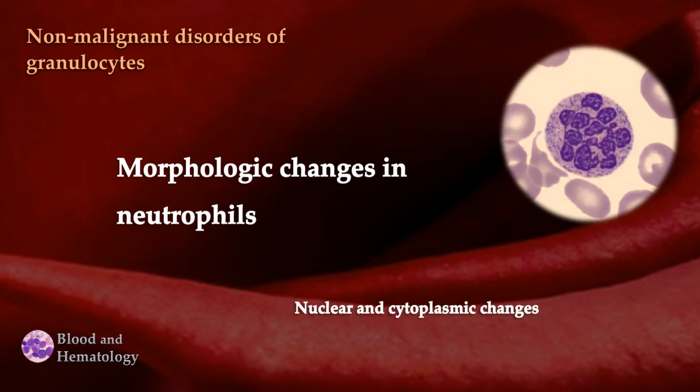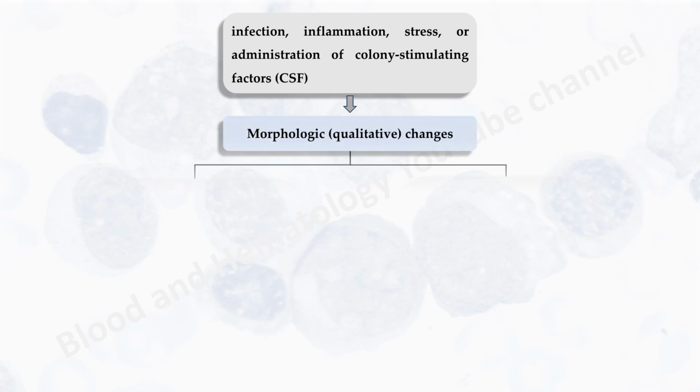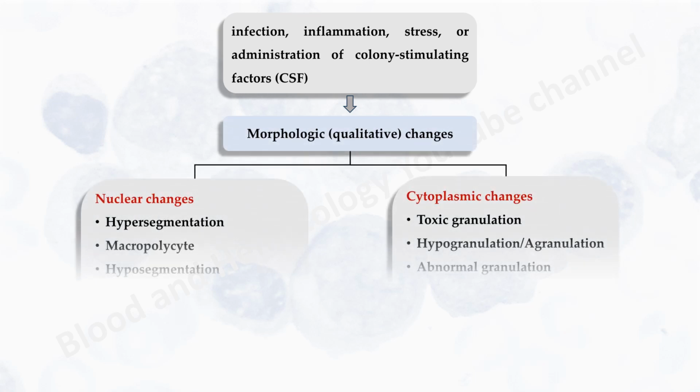This video is about morphologic changes in neutrophils. Conditions such as infection, inflammation, stress, or administration of colony-stimulating factors induce morphologic or qualitative changes in nucleus or cytoplasm of circulating neutrophils.